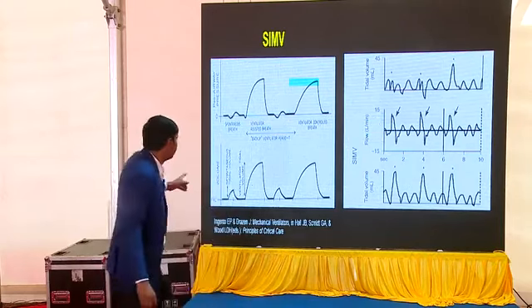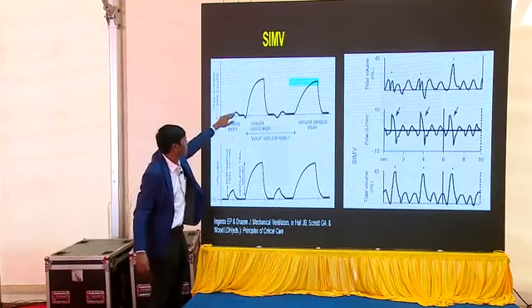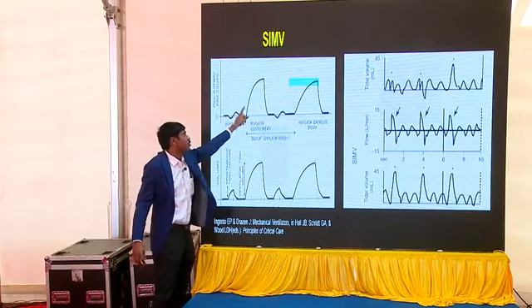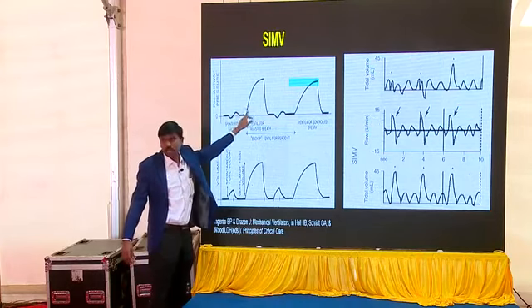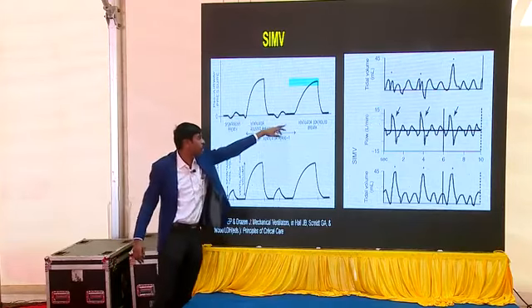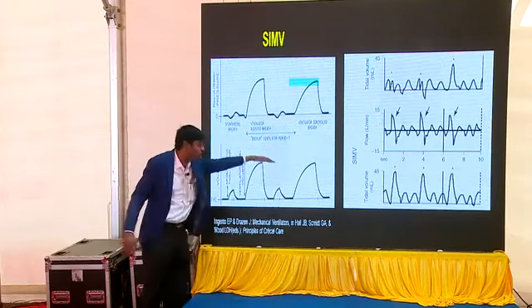So you find here, now if you see here, this is a baby breath, baby initiated breath. That's called an assisted breath. That's called a control breath. Now you see in both ways, you can see enough pressures and enough volume is reached here.